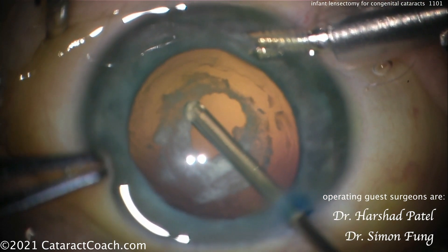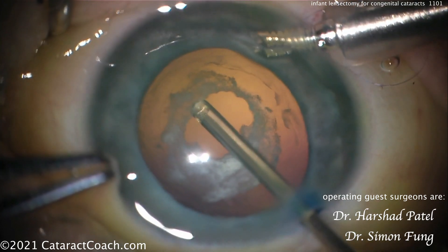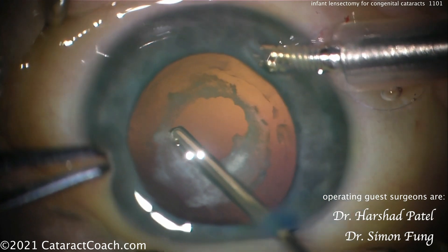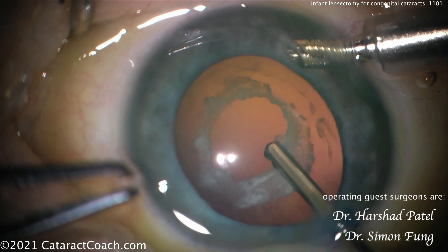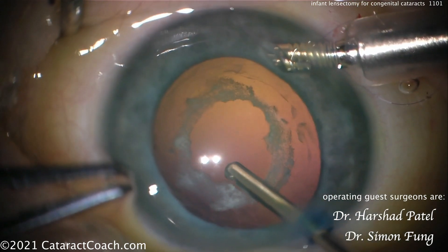This is going to be a really nice result — a beautiful job here. I'm really thankful to Dr. Patel and Dr. Fung for sending over this video to show their expertise. Dr. Fung is a faculty member at UCLA and specializes in pediatric ophthalmology, with obviously a very large experience doing these types of infantile lensectomy cases.